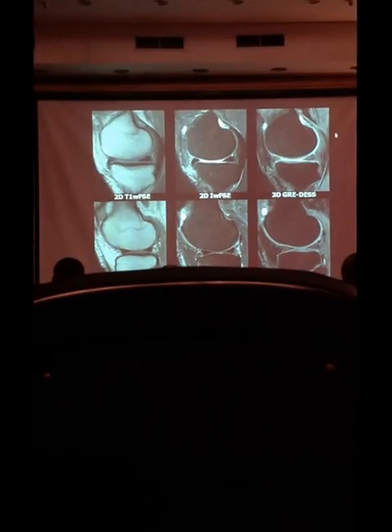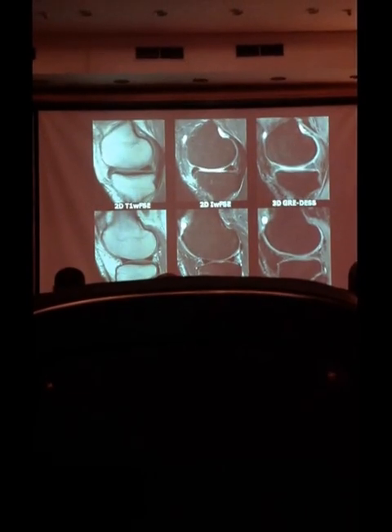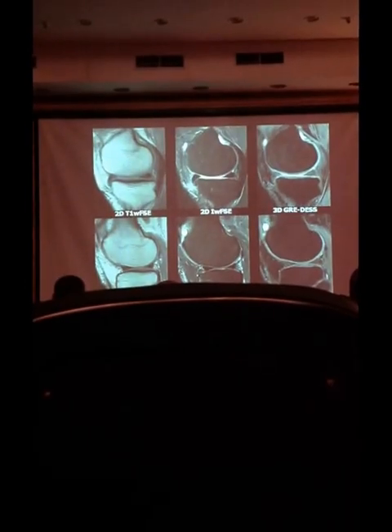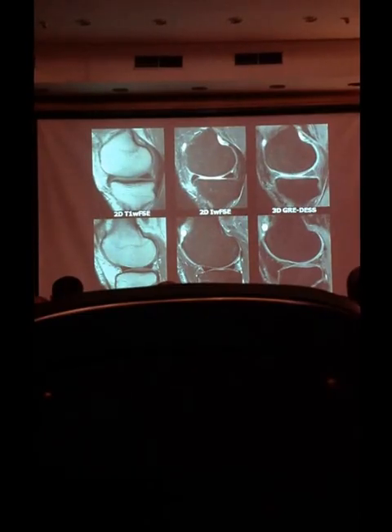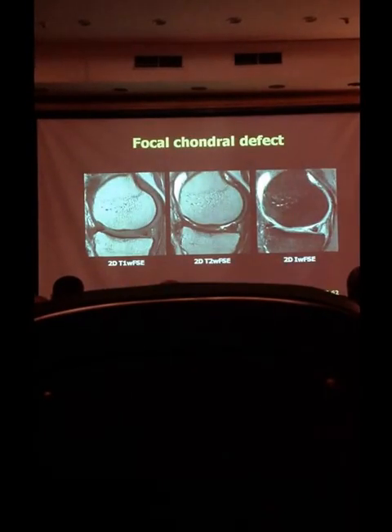And here I show you an example of a gradient echo sequence. We don't really have to know which sequence we're dealing with, is this a gradient echo, spin echo, whatsoever. When you see an image, it's important to see that we have good contrast between different structures. So we can see in these two sequences, we have excellent contrast between cartilage, the synovial fluid, and the subchondral bone. And that's okay to evaluate the morphology of cartilage.